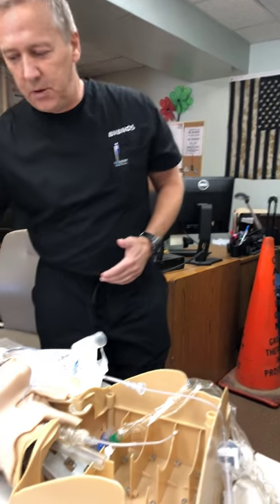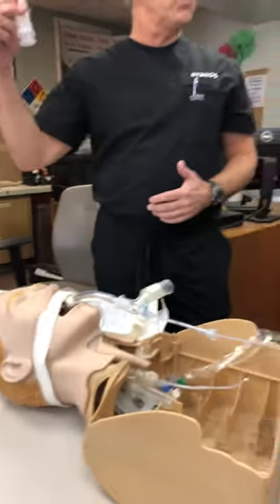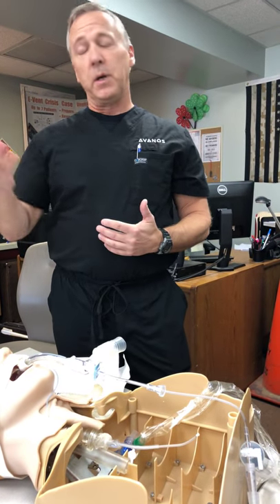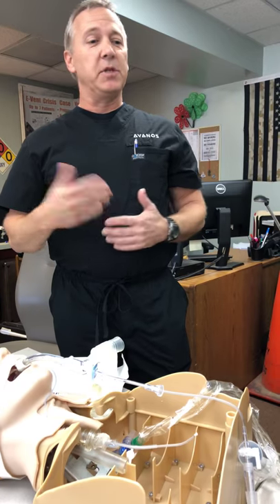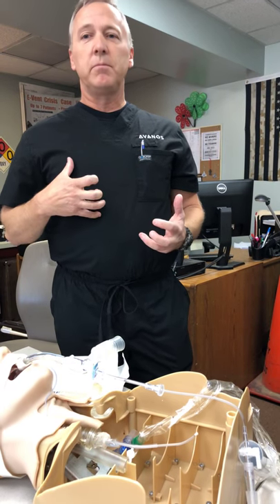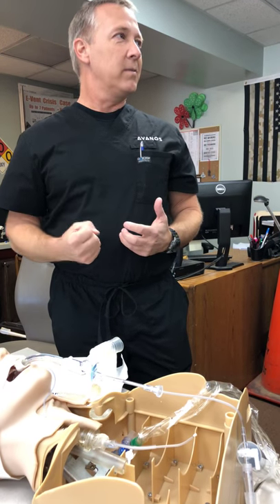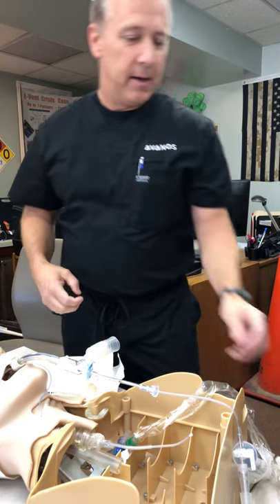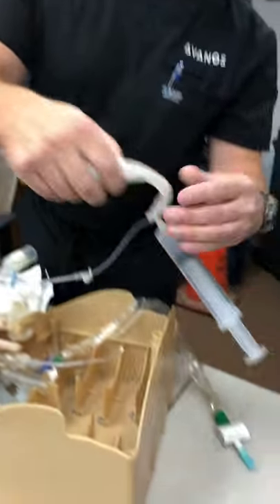You have two 60 milliliter syringes — you could safely go both of those. We're looking for a very, very small sample. Sometimes you're going to get it on the first suction, sometimes you're going to need a little bit more. Once we get the five cc's, at least we got that. Then we just kind of start disconnecting our components.